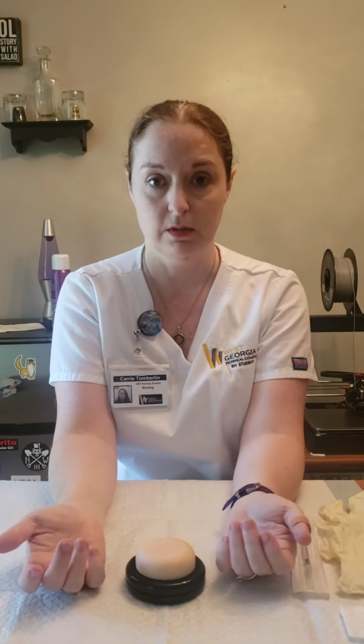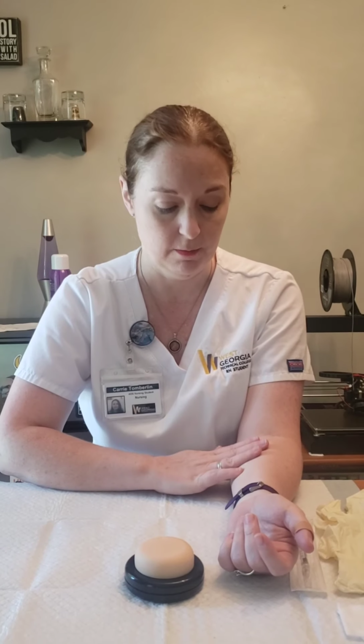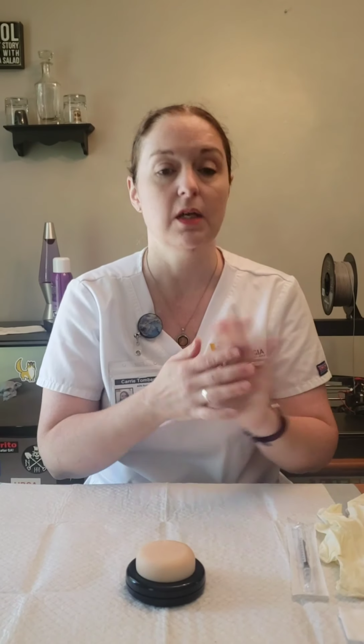So I would perform hand hygiene, wash my hands. I would position my patient with their arms out, palm facing up, their elbow bent, relaxed. I would select an area on their forearm that is free from heavy hair, veins, sores or scars, or anything else that might make it hard to read later. And then once I've selected which arm and where I'm going to put the tuberculin, I would wash my hands and put on gloves.